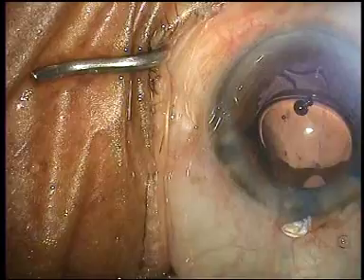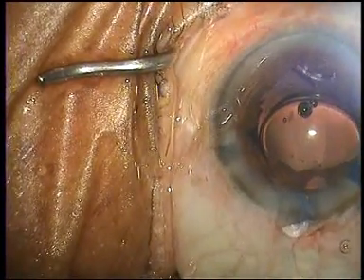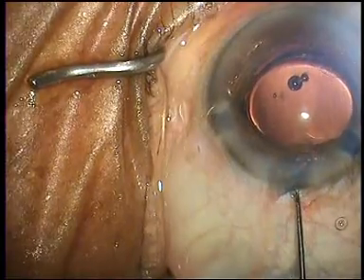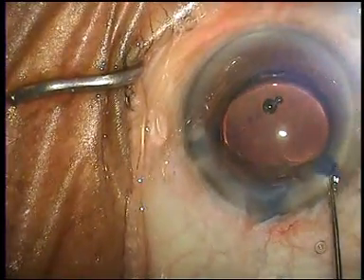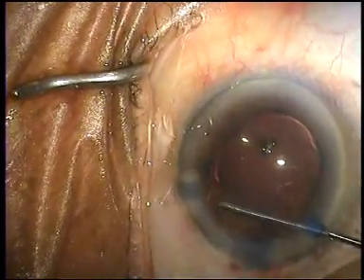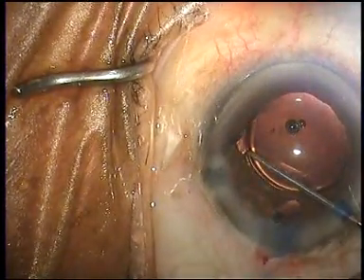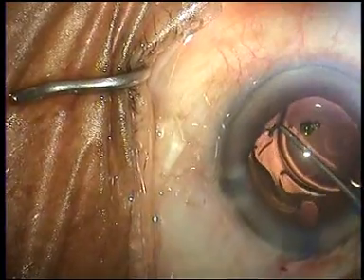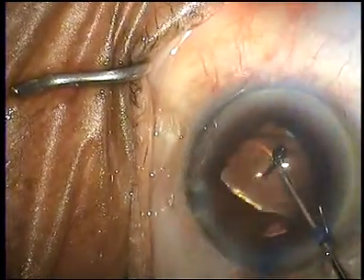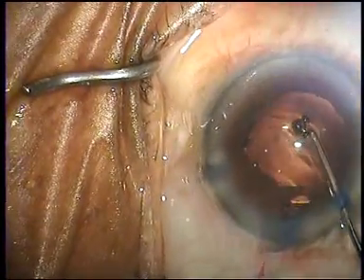Without the eye lock in place, the eye would move in an unmanageable way. Using the chopper on the other end of the eye lock, the lens is now rotated into the bag and the operation is completed in a safe and timely manner. I hope you have enjoyed watching this video — thank you.